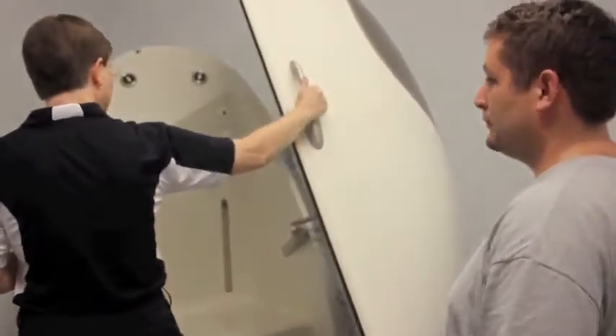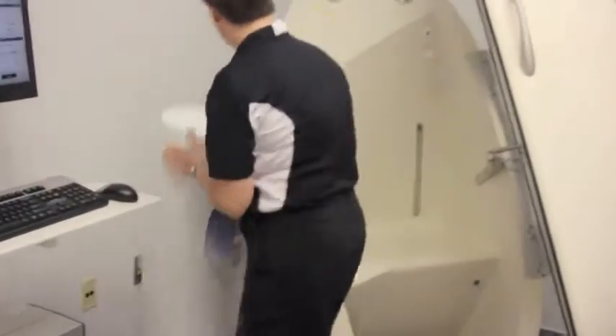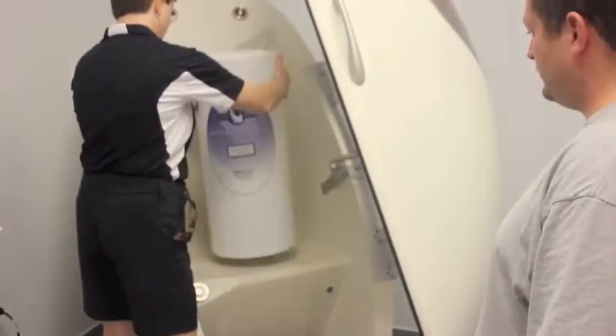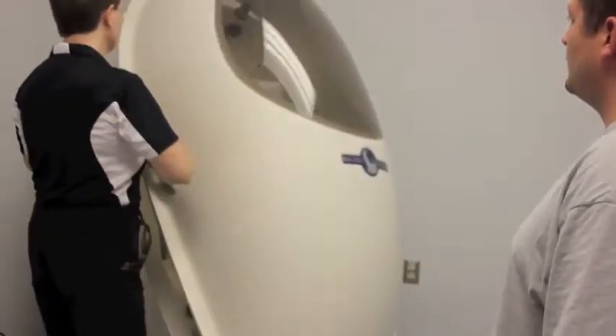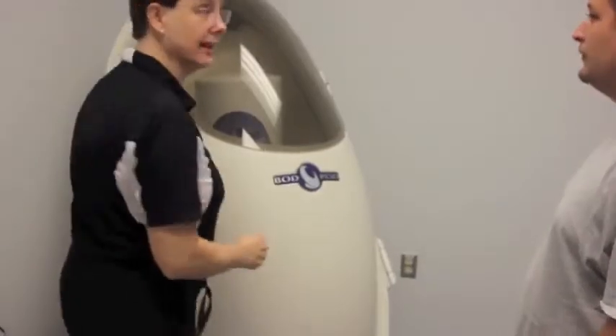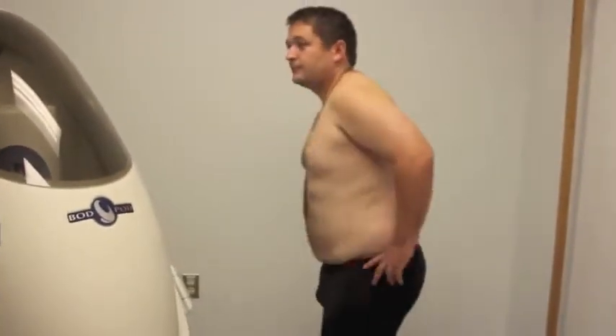We have this calibration cylinder which is matched to this machine. It has a known weight and a known volume, so we calibrate before every single test. Step off — don't go anywhere — we want to do it again.